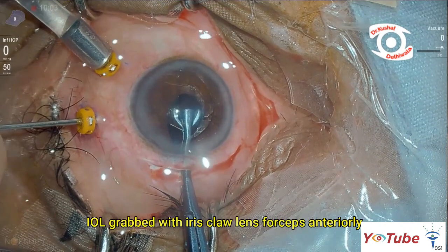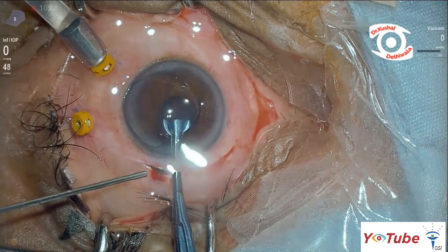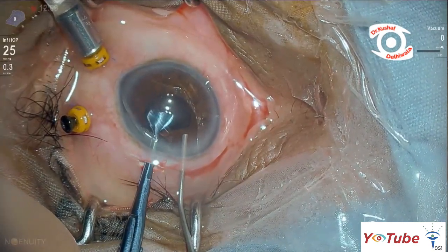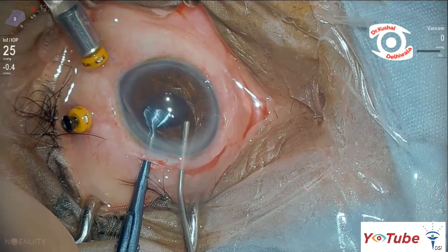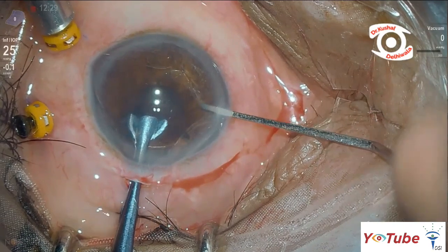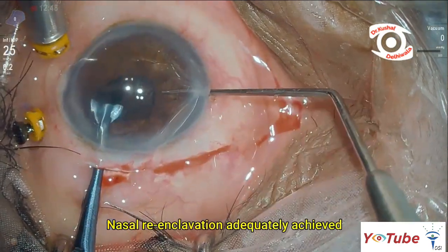The lens was re-grasped through an anterior approach using forceps through the scleral tunnel. This was followed by adequate nasal re-inclavation using a spatula.